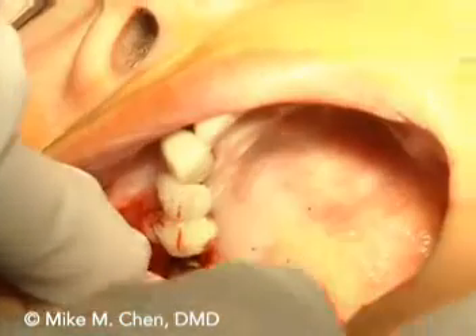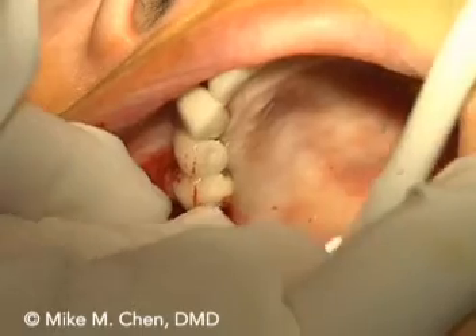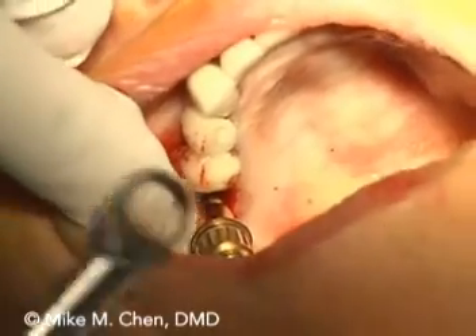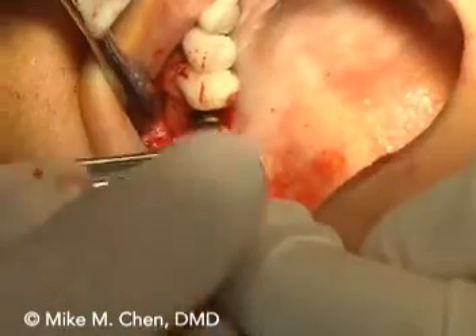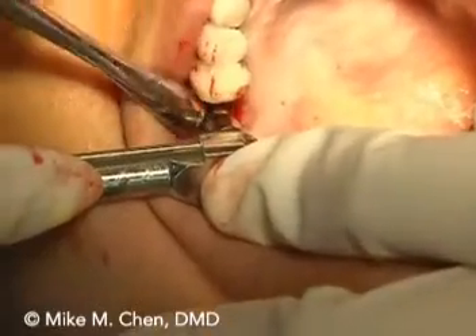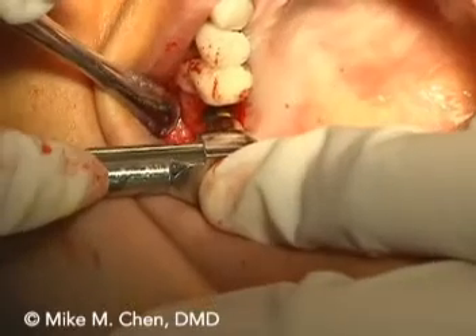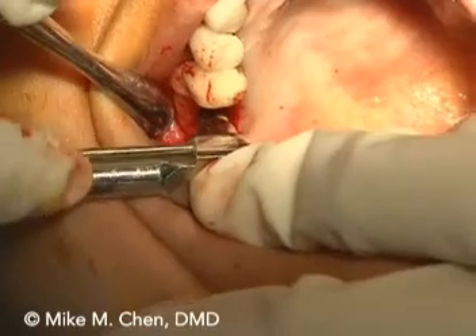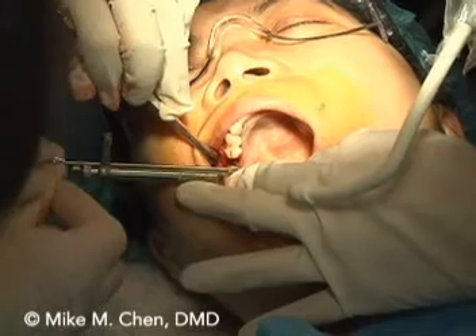This should drop right in. Go ahead and put this in. You can hold on to that. Go ahead. Got it. There you go. You want to make sure the butts line up. Can you feel it? Pretty tight, right? Yeah. That's what you want. Just hold.